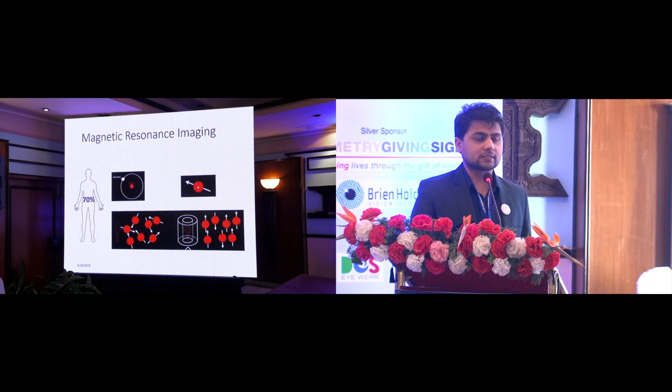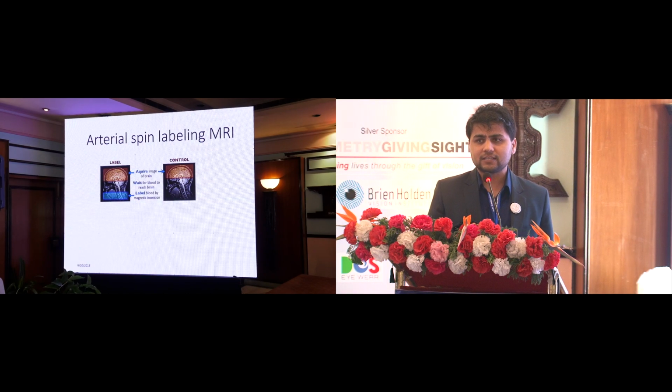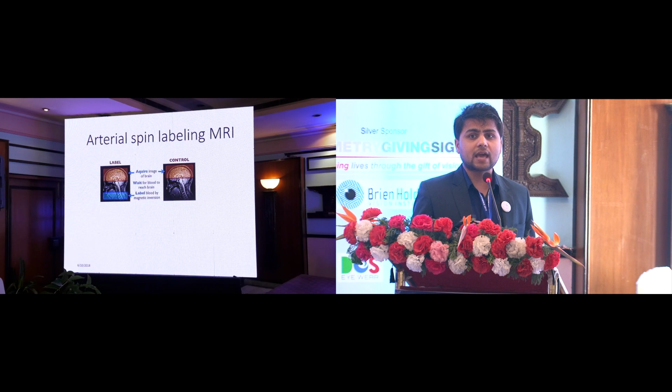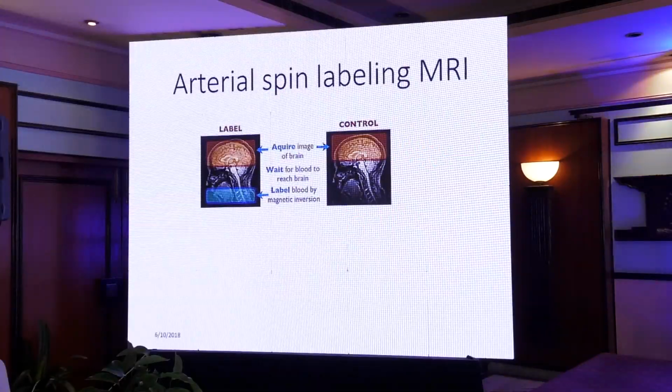Now, this technique called arterial spin labeling is really beautiful in the sense that it offers a non-invasive method to get the measures. That means you don't have to inject any contrast agent. It relies on the blood itself to generate that contrast. The other thing is it gives you quantitative measures of perfusion, so that you can compare across different centers, or you can also follow that person longitudinally in time.